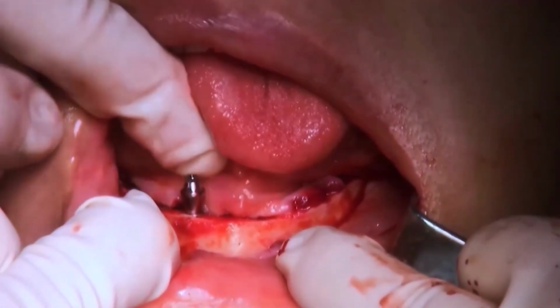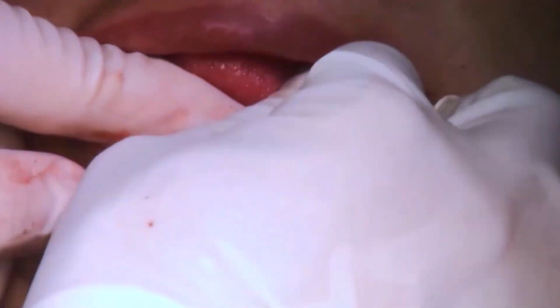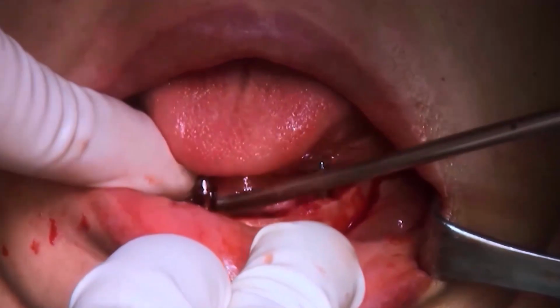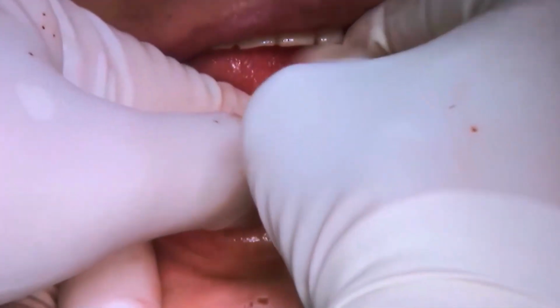After connecting the abutment, I check whether the abutment cuff height is appropriate or not. If it is not, you can change it. Whenever I connected the abutment, I checked the level of the abutment. The shoulder of the abutment should be above the mucosa level.